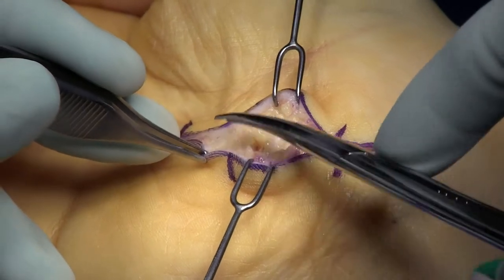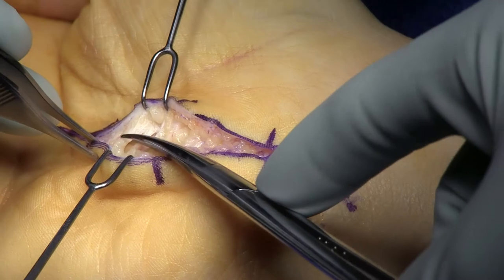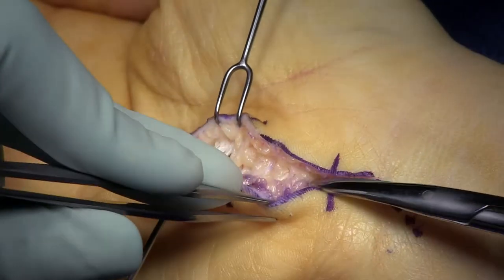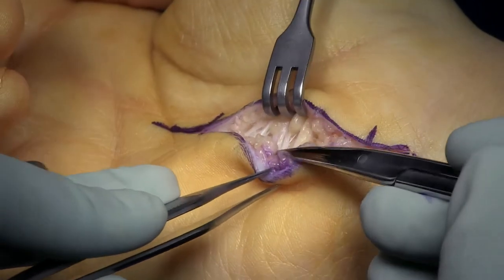In this 22-minute video, I'm emphasizing some of the subtle techniques with respect to the carpal tunnel. And one of them is to have your assistants follow you when you're doing the surgery — where I'm operating, I want my assistants to be.